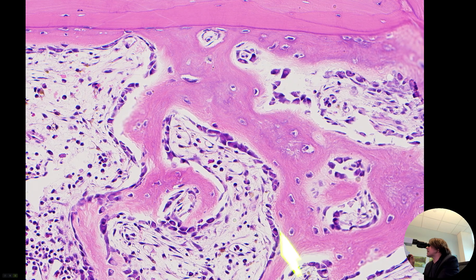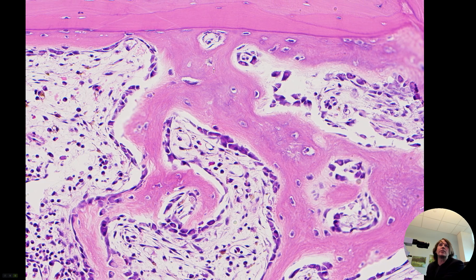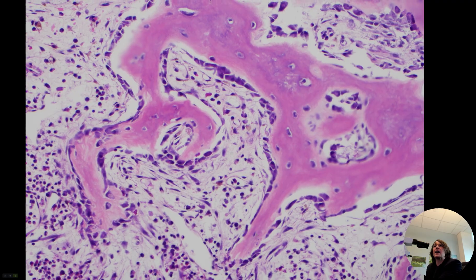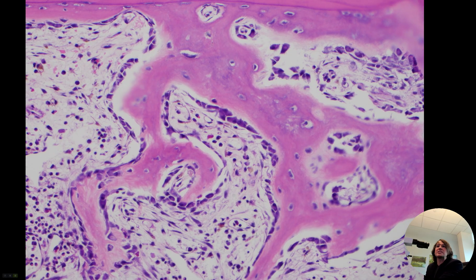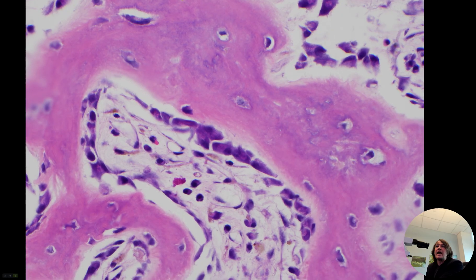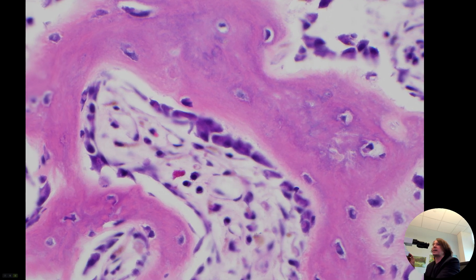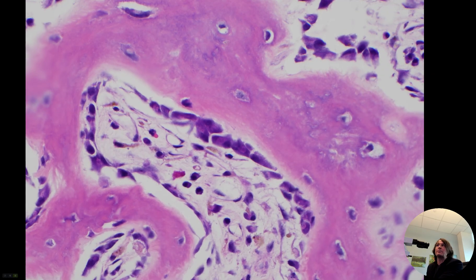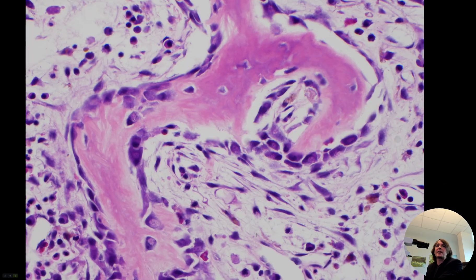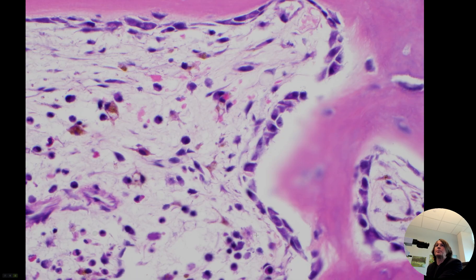This stuff that's kind of stuck on to the outside of it is new woven bone. The cells that are making that woven bone are osteoblasts. They look kind of plasmacytoid — they have an eccentric nucleus off to one side and purple cytoplasm, even with a little pale area like a perinuclear Hoff, like you see in plasma cells. So osteoblasts can actually kind of mimic plasma cells microscopically, but we know they're osteoblasts here because they're lining up around this new bone.